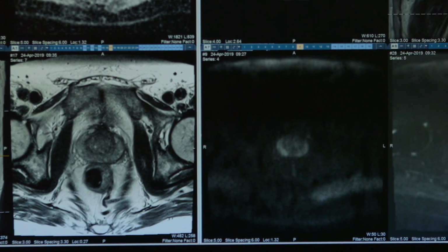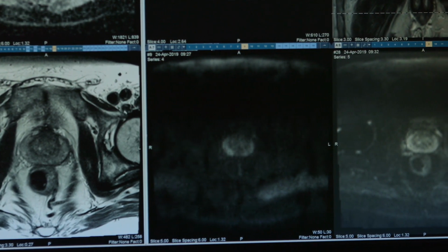I think that it's becoming standard of care to recommend multiparametric prostate MRI in the appropriate settings. We're able to identify cancers that often get missed otherwise. And then the next step after that is, once we identify them, we're able to actually guide the urologist to target those specific areas to biopsy them correctly. It greatly increases accuracy and ultimately improves patient care. So it really is a great benefit to the patient and to the urologist.